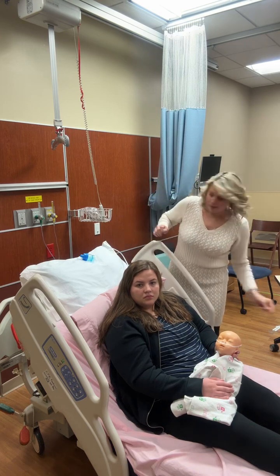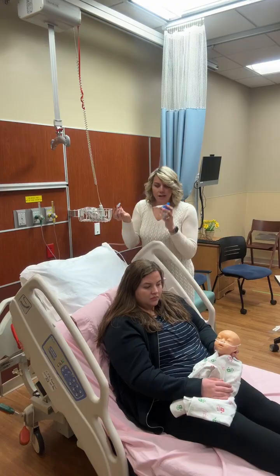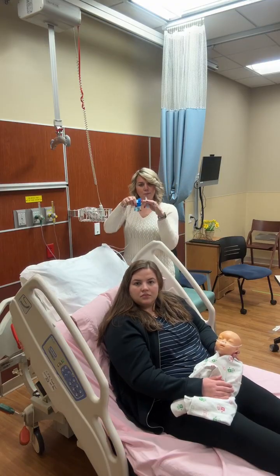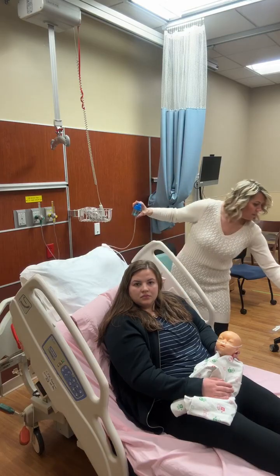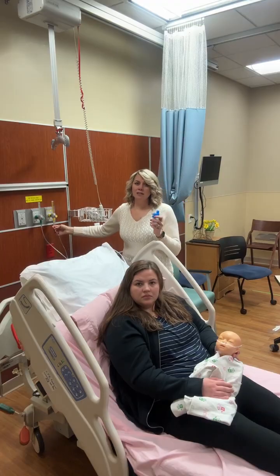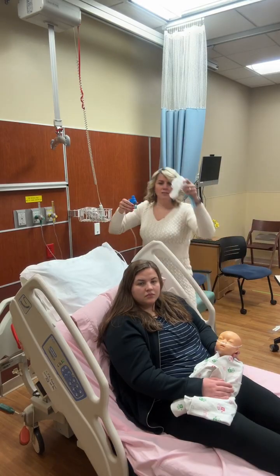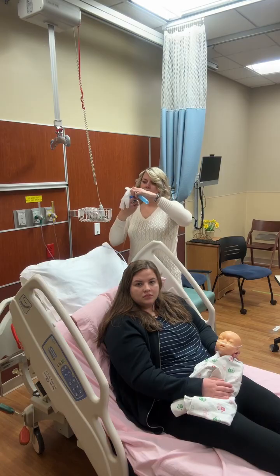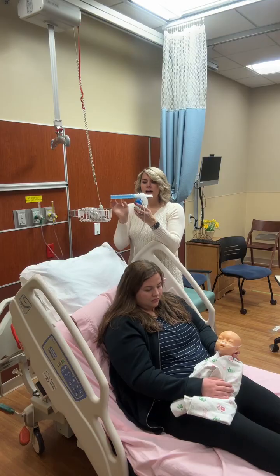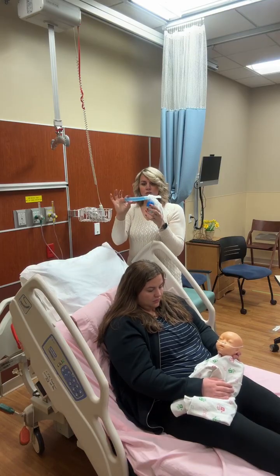So I'm going to set this down for a second, and for the purpose of showing you what the nebulizer does and sounds like, I did my med checks, and I'm going to put the med in here just like that. I put it in the hole. I did not have to take off the top, all right? My tube is already connected to air because we're always going to give the breathing treatments with air. And then I'm going to connect the mouthpiece, the T, okay? So now I have my liquid in here. My mouthpiece is closed off, and I have this tubing here.